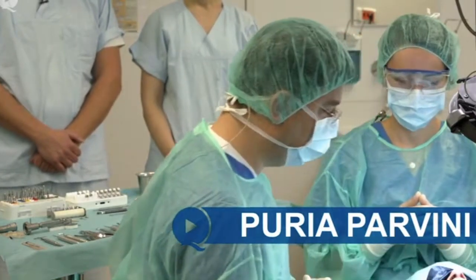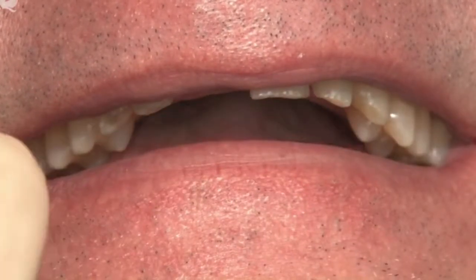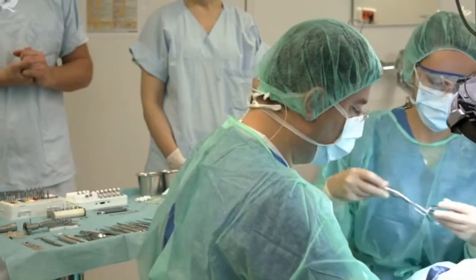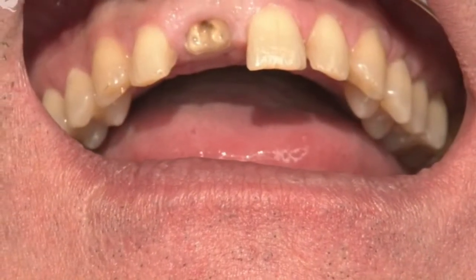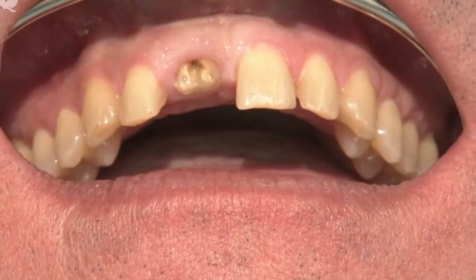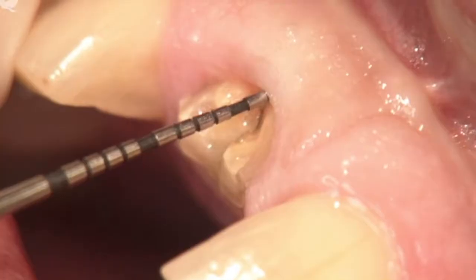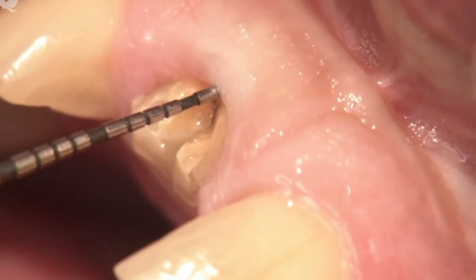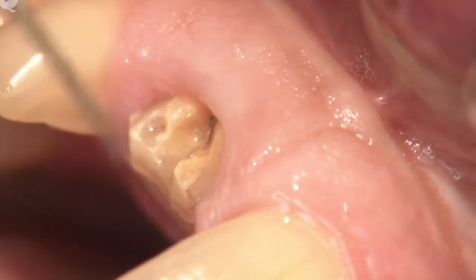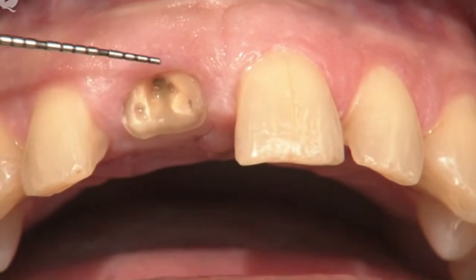Let me briefly present this male patient. Could you give us a smile please? We see a very low smile line. This is the way we always proceed — we first take a look at the patient clinically before we take an x-ray. Next we look at the gingival situation. The gingival is quite thick, so this is a thick biotype. We also see that the gingival scallop is going to work for us.